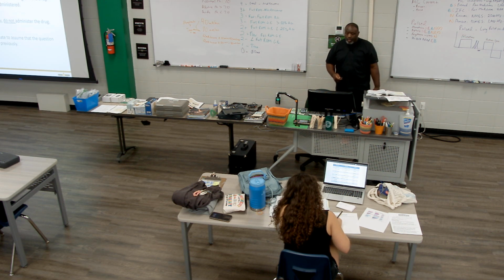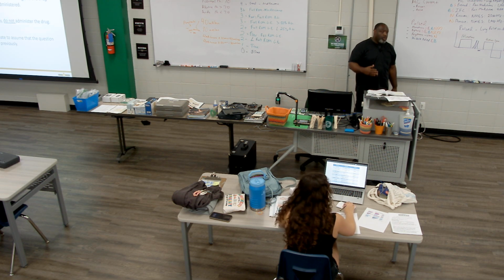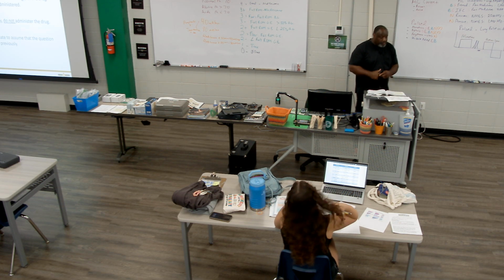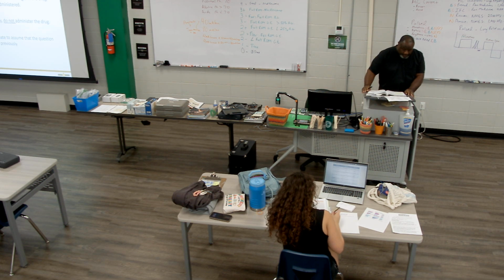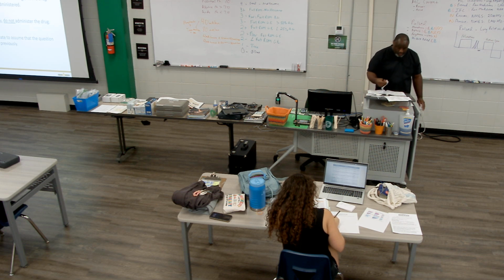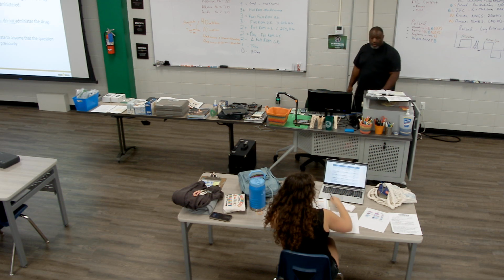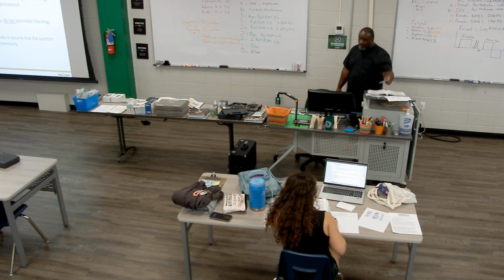Okay? Always be careful to ask your patient, are they allergic to the drug? Not just the electrode, are you allergic to certain drugs and medications? You want to explain to them exactly what you're doing. That's very much so important. Always explain to your patient what you are doing. I'm getting ready to use a medication. On one end, on these, it'll just be medication under the electrode.